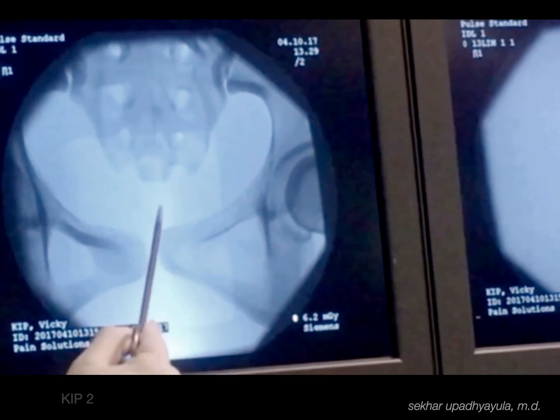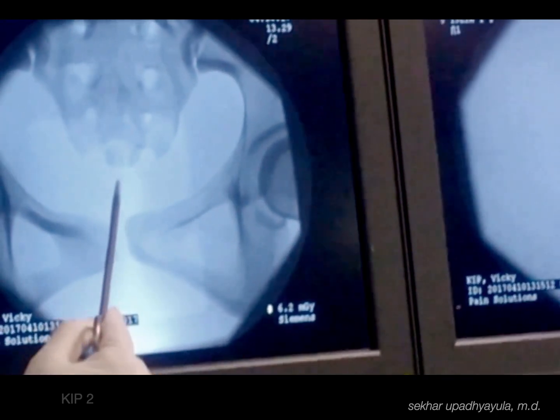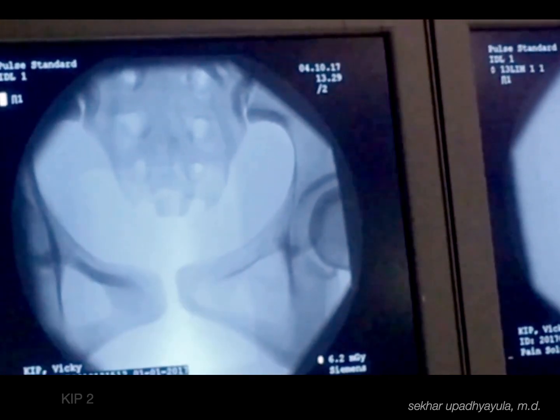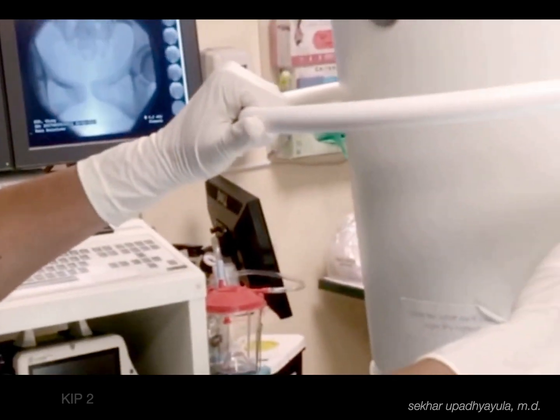This is the coccyx. The coccyx doesn't seem to have the usual extension. Normally we'd see 5 segments that are fused. As we see up here, we can see the traces of the sacroiliac joint. Now we're going to move up ever so slightly.